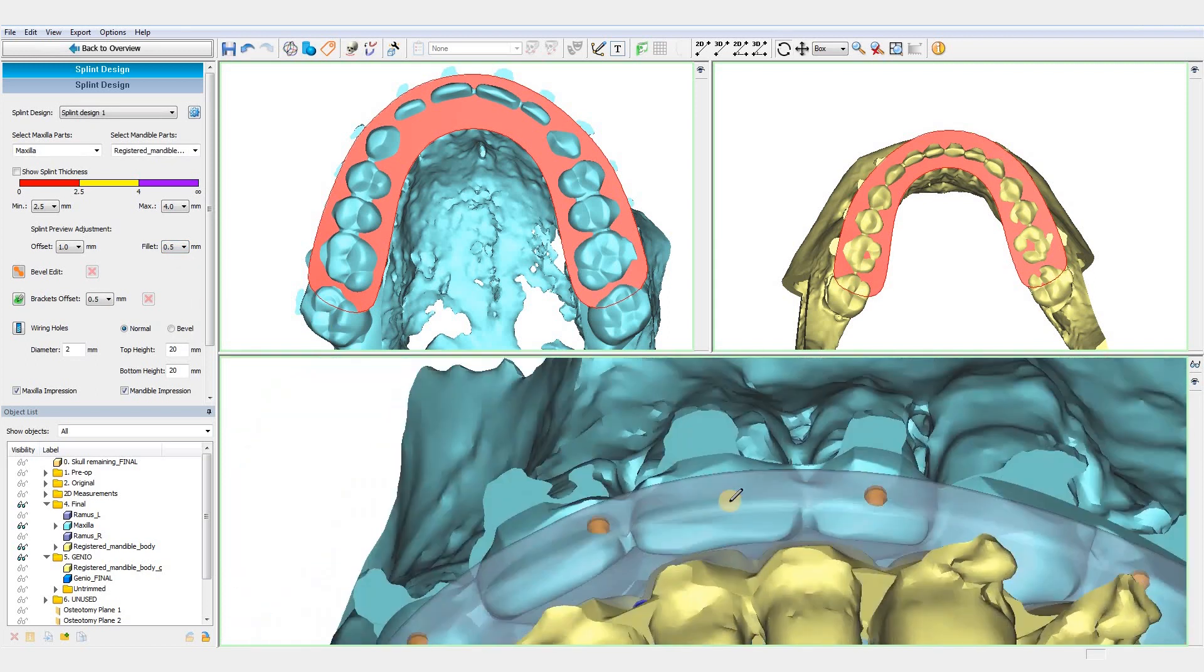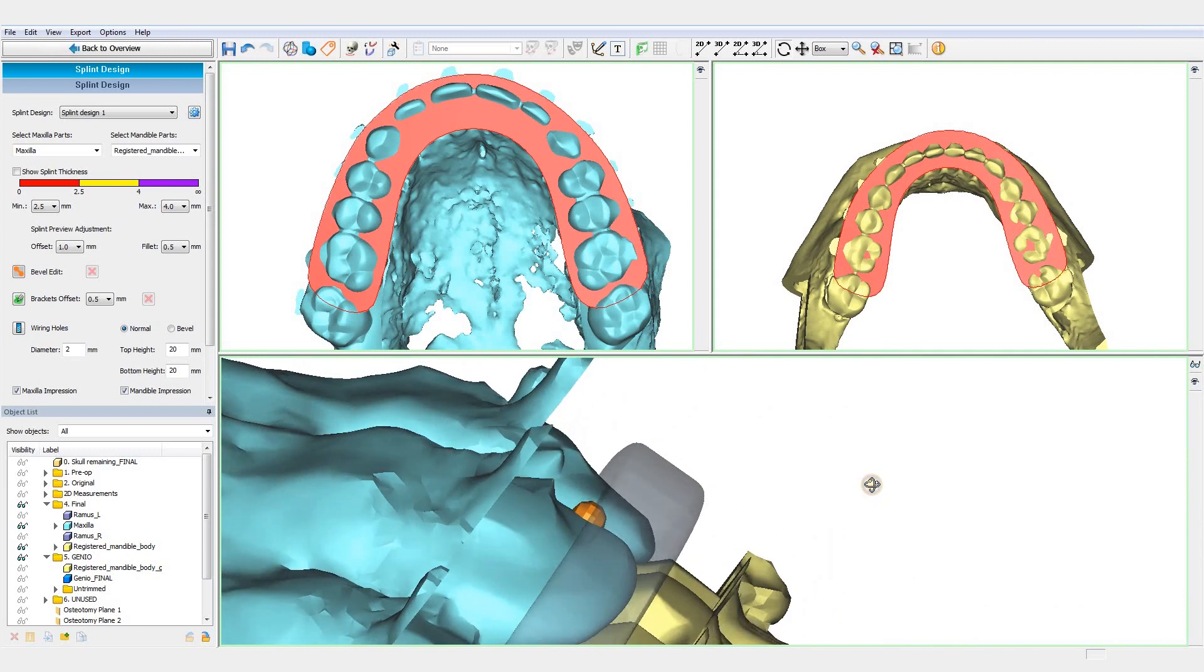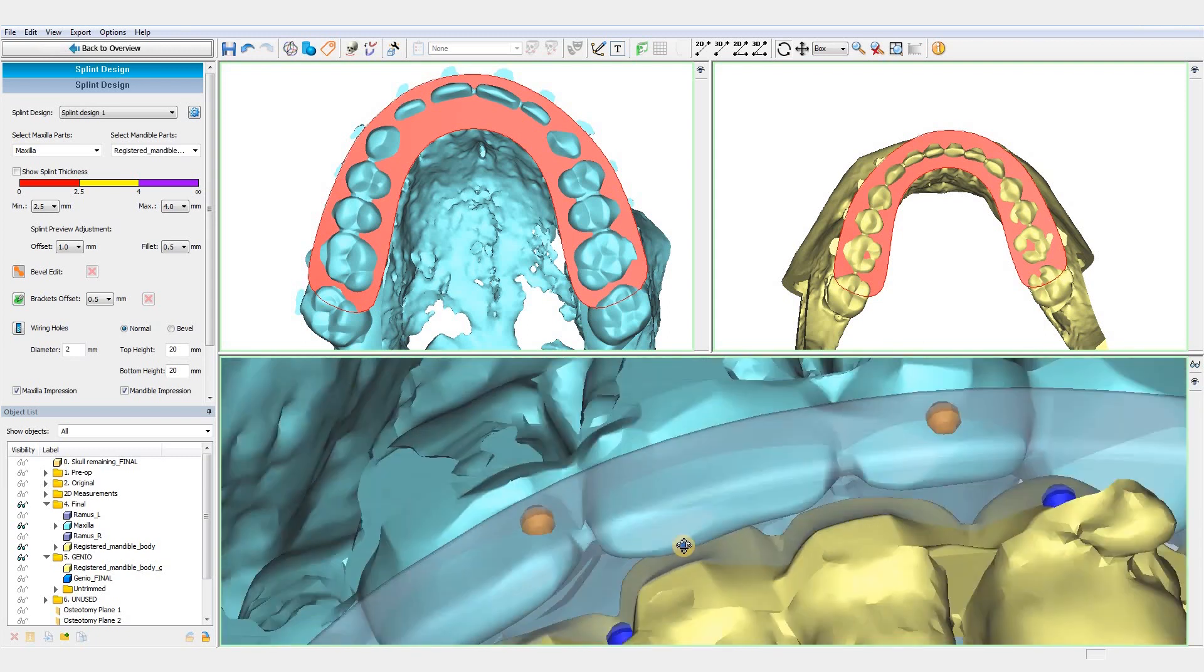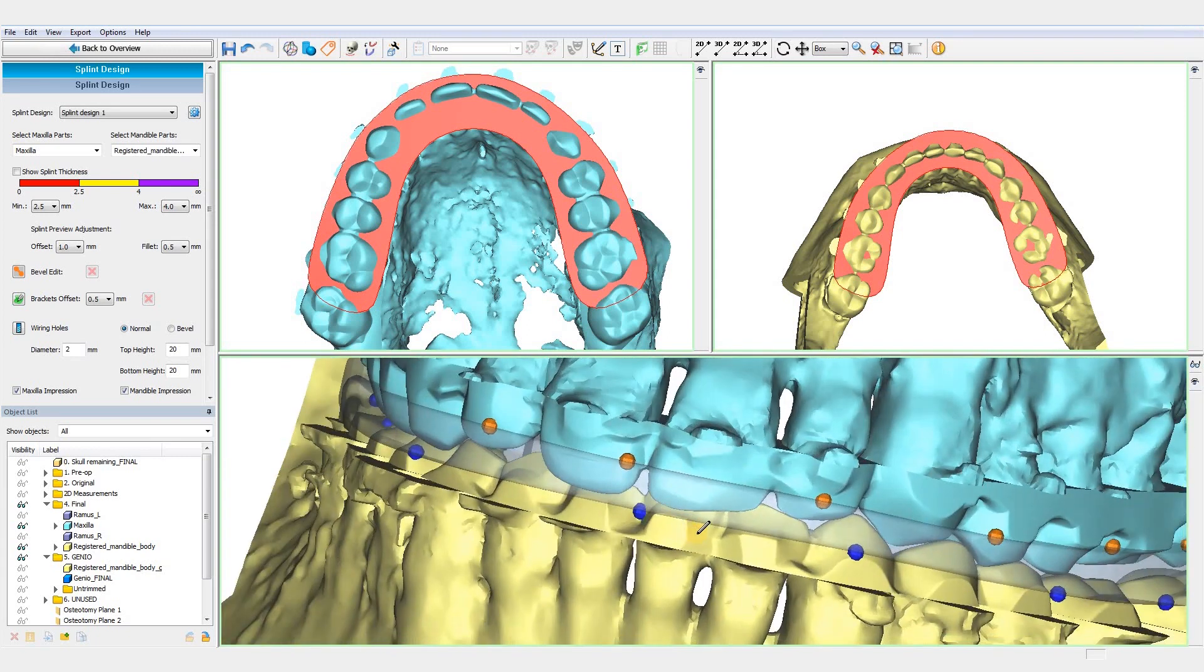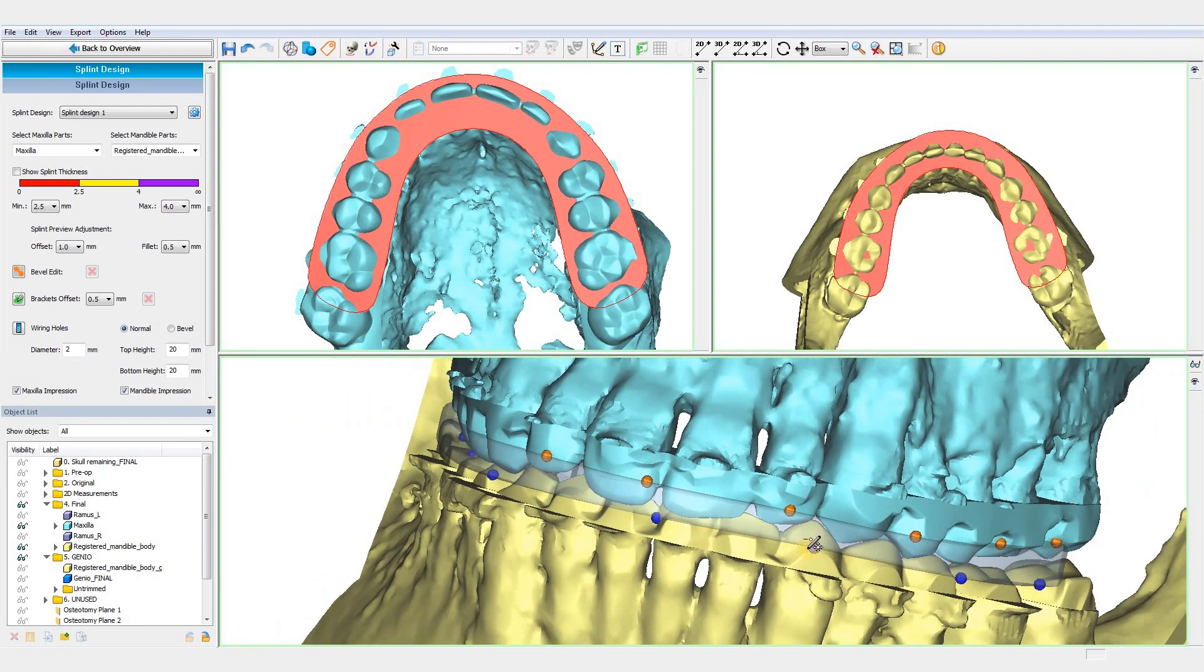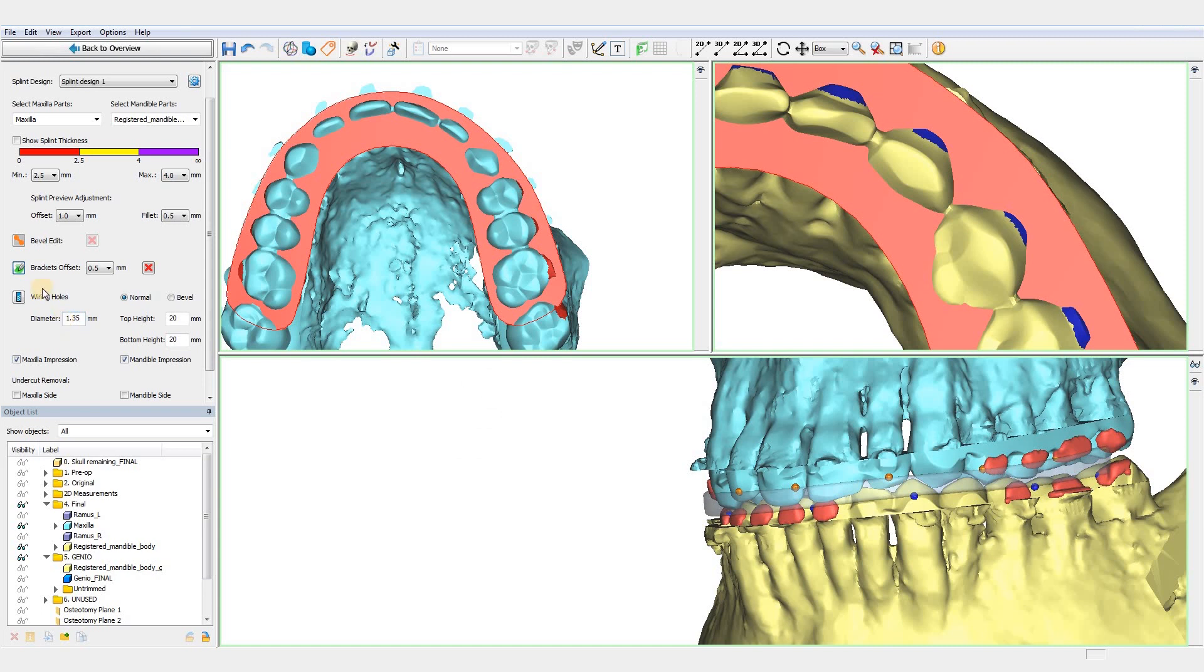Another option is the fillet option, to round the edges of the splint and remove any sharp edges. Placing wiring holes is also possible with this option.